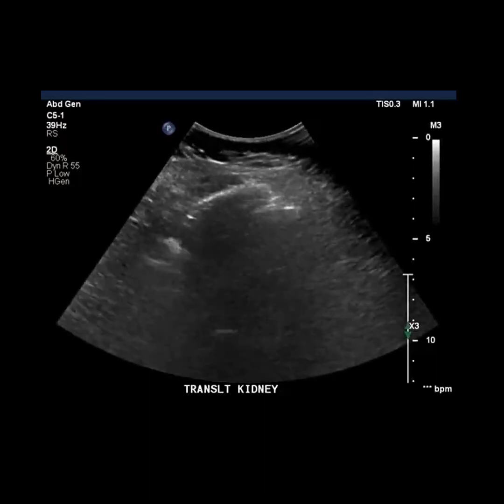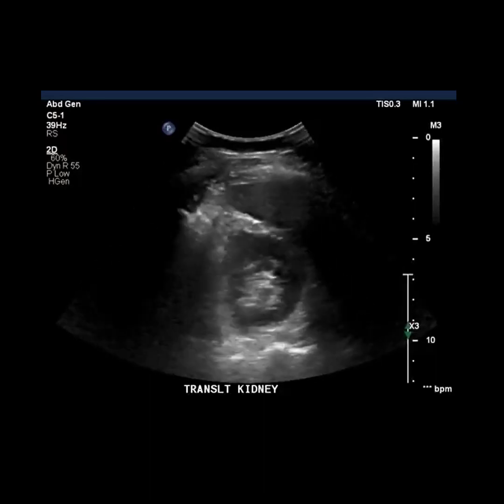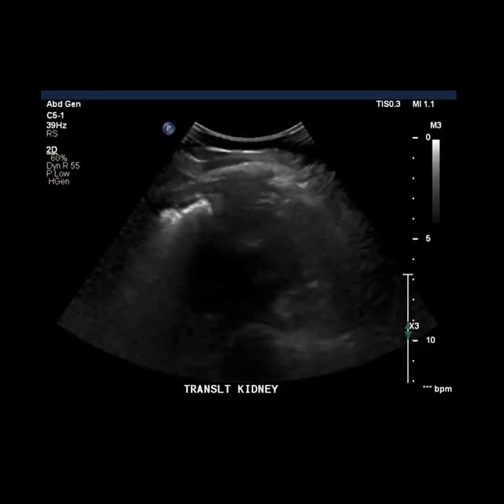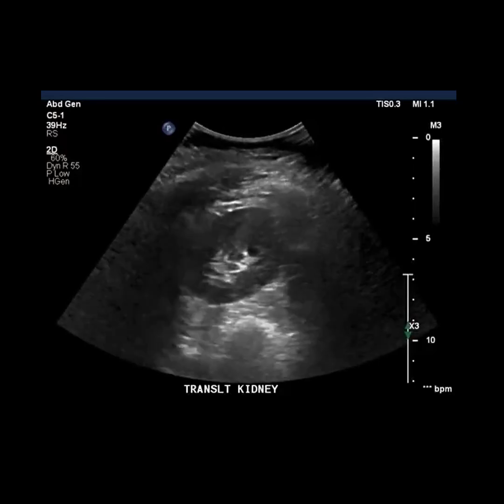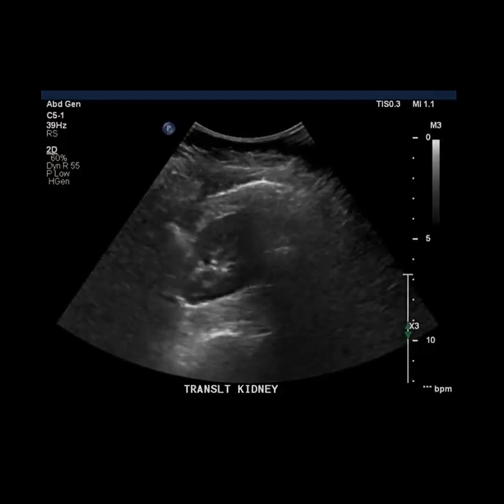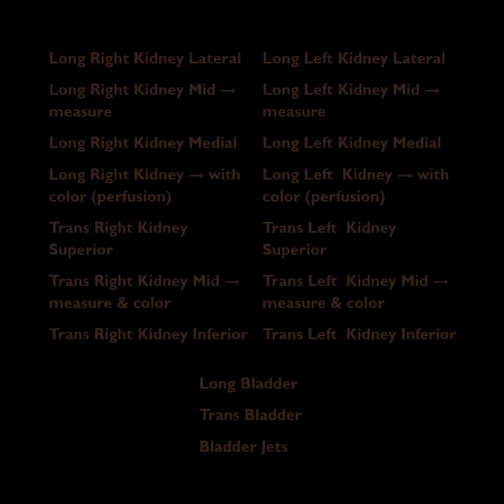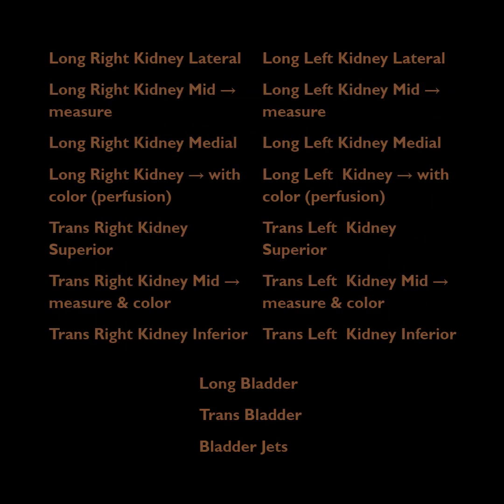You can see from our protocol images that you should move through the kidney in a very systematic way. We measure at the mid portions in both planes and will evaluate for perfusion.